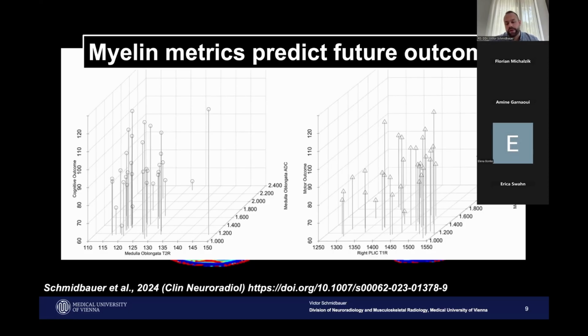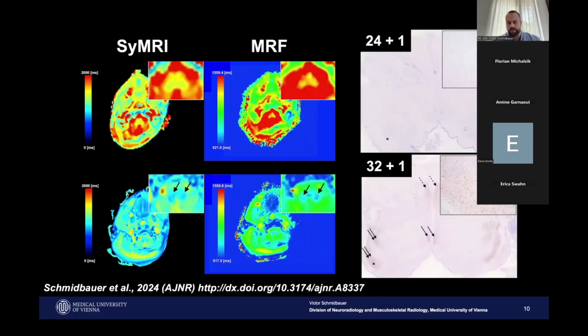So maybe you ask the question, bluish color codings and relaxation time shortenings, we know that this is associated with ongoing myelination processes, but how do they prove that this is really myelin they are looking at? And of course, we also made an attempt to prove that. And as mentioned, at our institution, we do a lot of fetal imaging. Of course, fetal imaging in vivo, in utero.